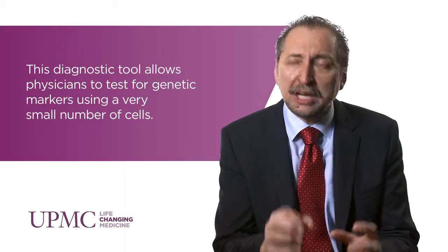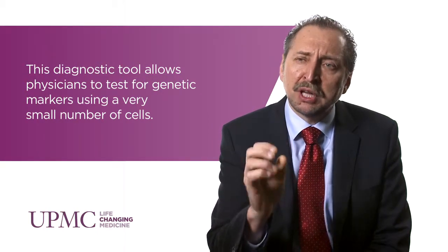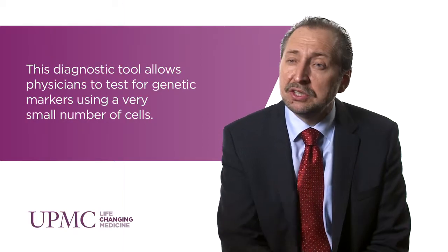Until recently, next-generation sequencing, this very powerful new technology, has been used only in large tumor samples, and it has never been used in the very small number of cells that can be collected by a thin needle from the nodule. We, for the first time, validated the use of next-generation sequencing specifically for thyroid nodules and thyroid cancer, and demonstrated that even very few cells collected from the nodule will allow us to provide a very reliable diagnosis of benign or malignant process in a given thyroid nodule.